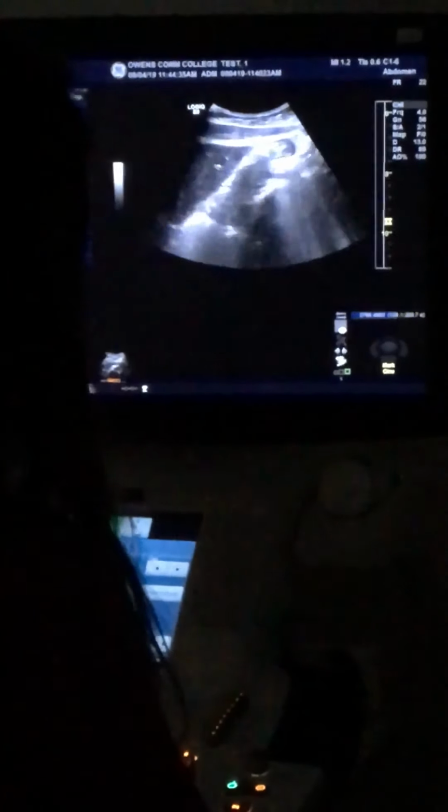All right, so long left lobe, the first image is at the lateral edge. That's the landmark you guys have. So basically that just means I want to scan until I don't see left lobe anymore. So I'm angling towards her left side. And some people have a really large left lobe and some people have a really small left lobe. The person we scanned earlier this morning had a really large left lobe, so it just kept going and going and going. So the biggest thing is just make sure you scan all the way through because cysts and masses are just as likely to sit over here as they are here. So you don't want to skip the edge of something just because it's harder to get to.